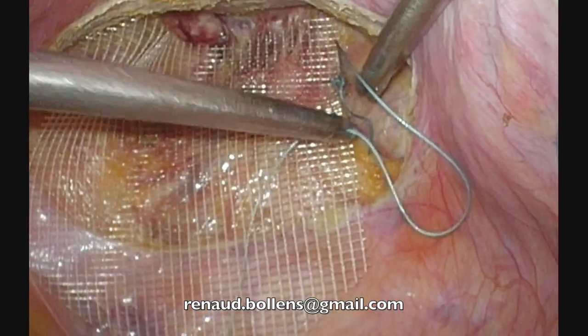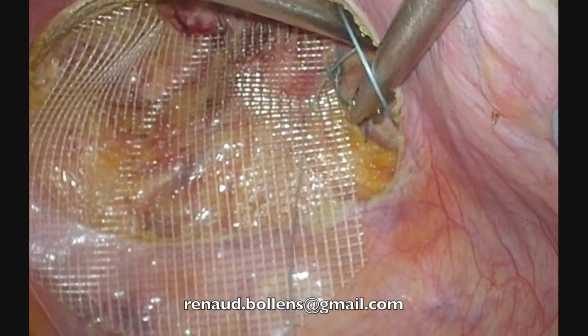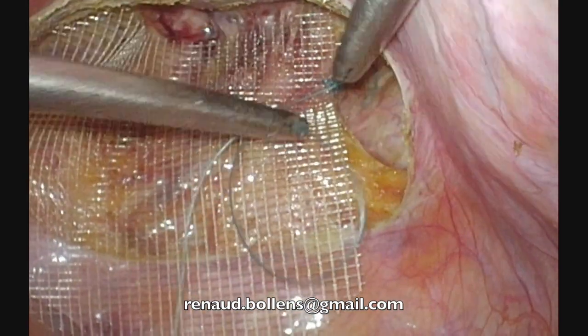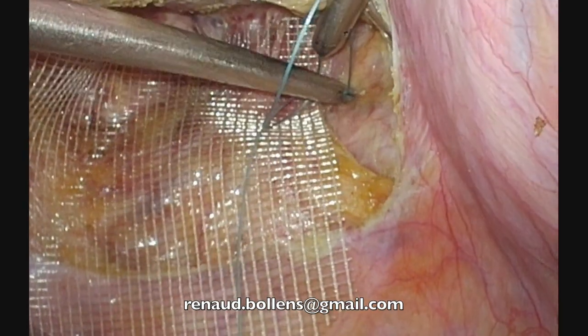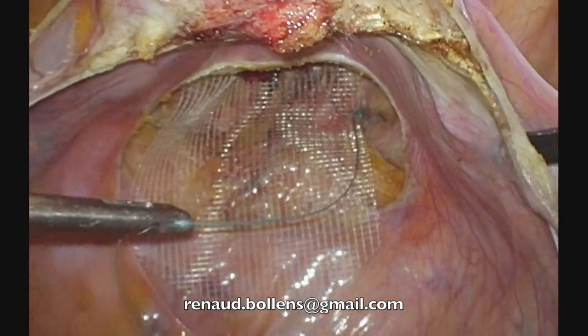Then you see, normal speed, half loop, I move my two hands, slide, jump over, and I tighten. Traction, half loop, I catch the short thread, I jump over and I tighten. Okay, basic techniques.